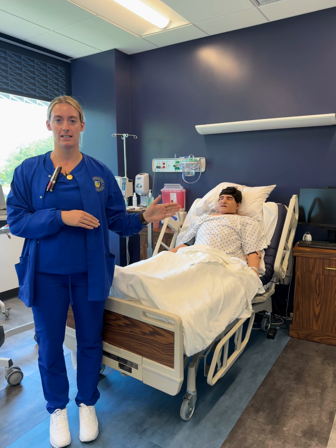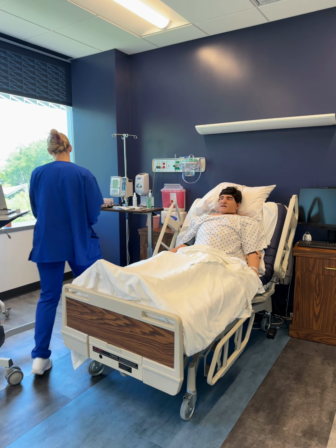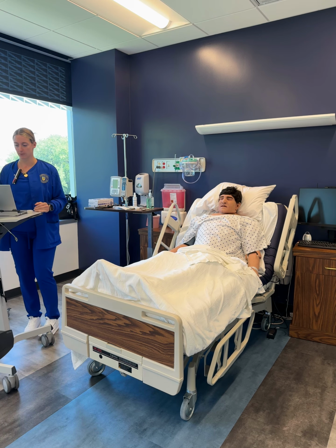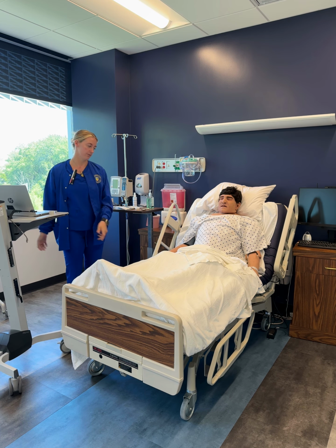I'm going to do the NG tube insertion and removal. Prior to entering the patient's room, I'm going to review the patient's chart, checking for history of nasal polyps, nosebleeds, anticoagulant therapy, chronic sinus infections, oral or facial surgeries, and aspiration. After that is done, we will enter the room.